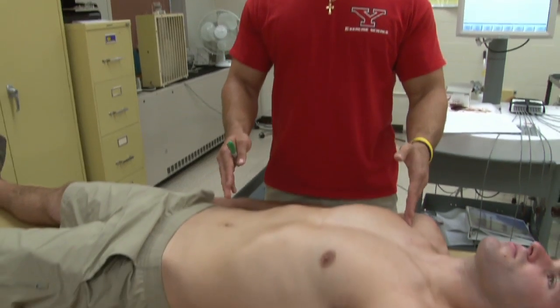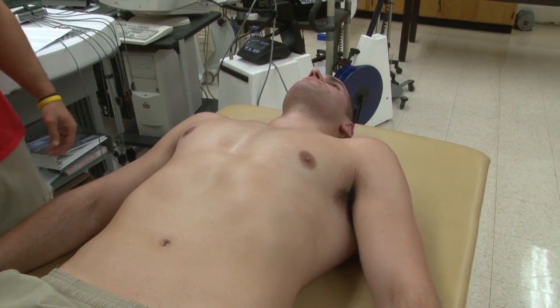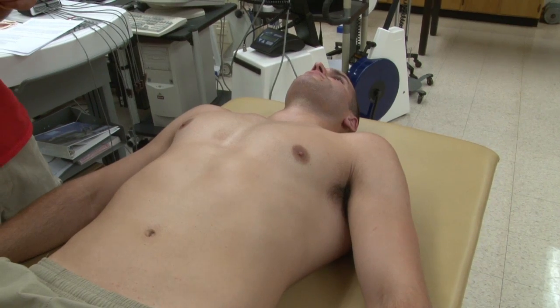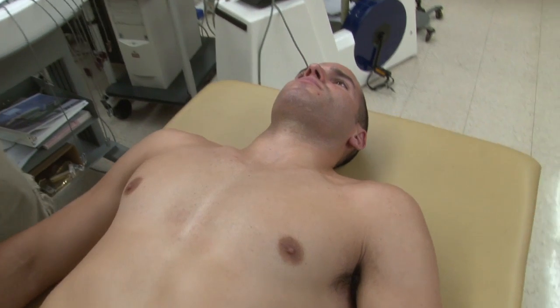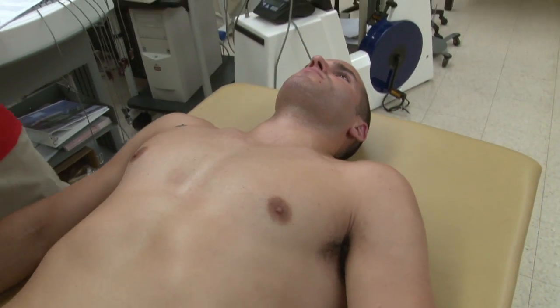For exercise, we typically place them more towards the midline. The reason is that if placed on the limbs and extremities as during rest, moving those limbs during exercise will cause artifacts and error in the ECG recording. The right limb lead is placed in the upper right aspect of the chest and shoulder region, just below the distal end of the right clavicle in the fossa. The left one is placed in the same area on the left side.